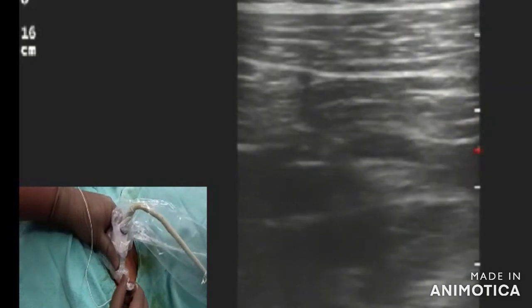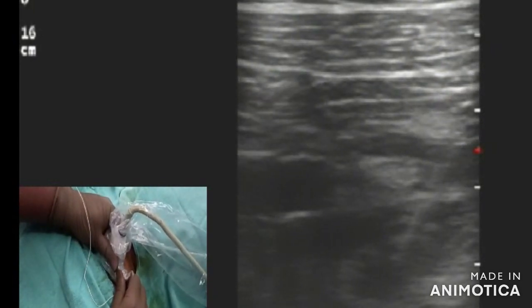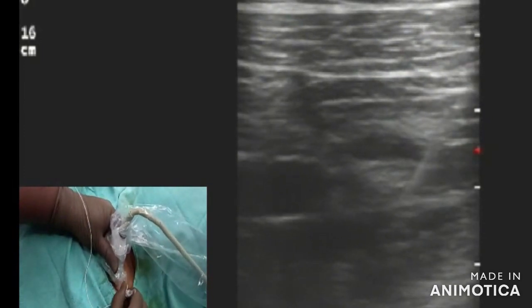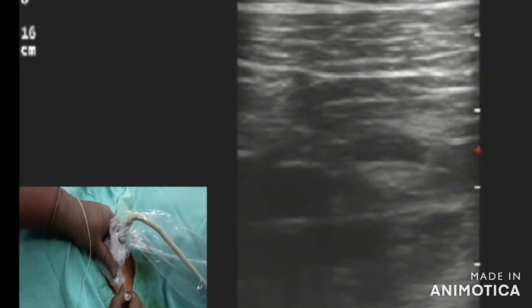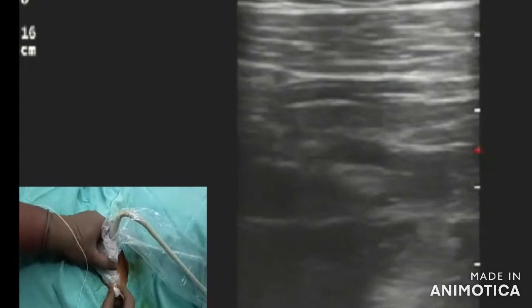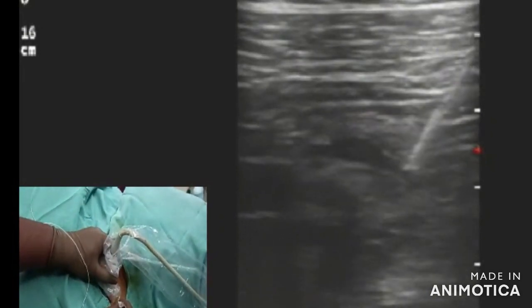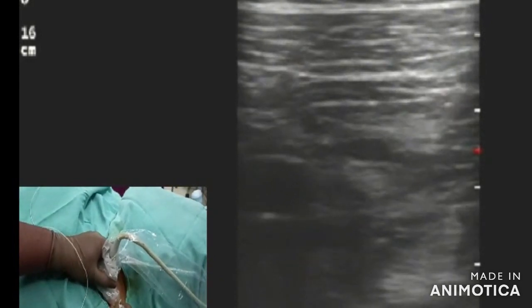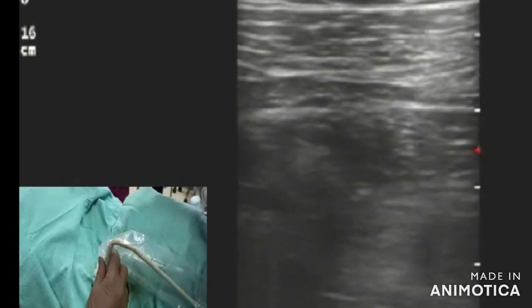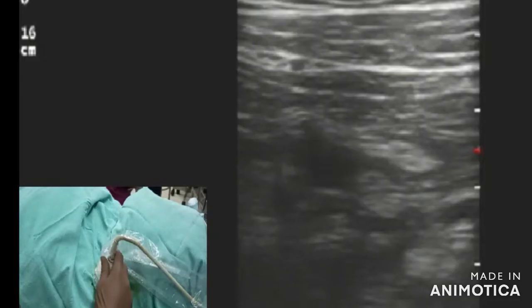The advantage of this costaclavicular block is that you can always place a catheter, and catheter displacement is unusual here — so if using a catheter, the medial infraclavicular (costaclavicular) block is highly advised. Another advantage is that the three cords are placed laterally in at least 95% of patients, lateral to the axillary artery. One important point: there is a case report of an aberrant artery running near the cords, so always apply Doppler before performing the block. Onset of block with this technique is five to ten minutes. You can see the markings — lateral cord, medial cord, and posterior cord.